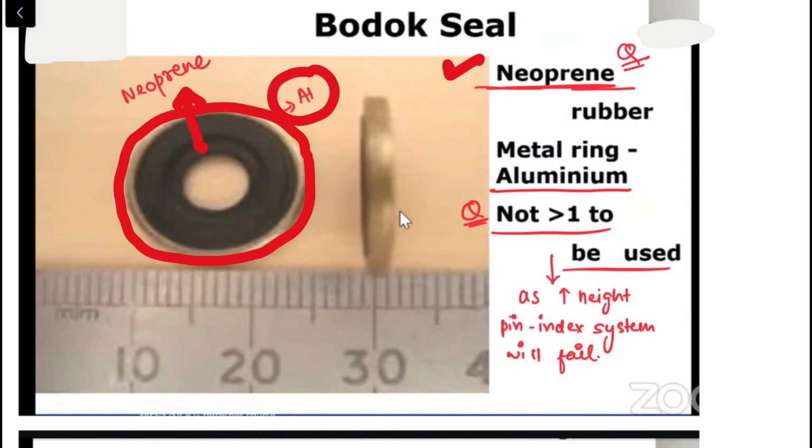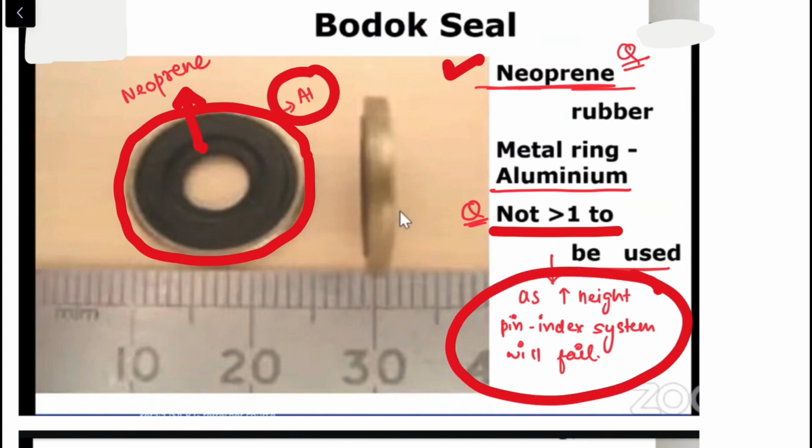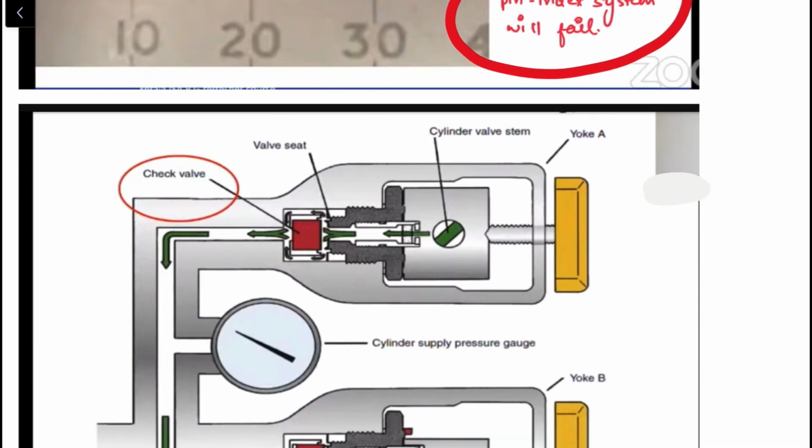Because you know that the cylinder is going to be fitted by the holes and pins, if you use more than one of these seals, it can actually bypass the pin index safety system. So the pin index safety system will fail if you use more than one Bodok seal.